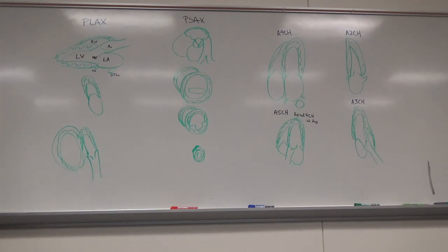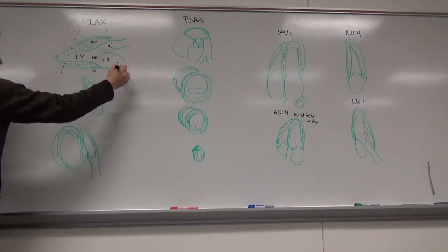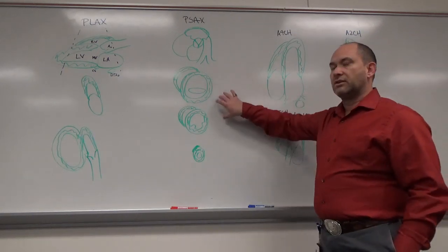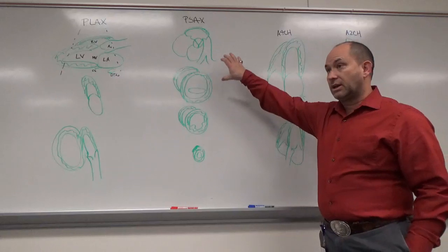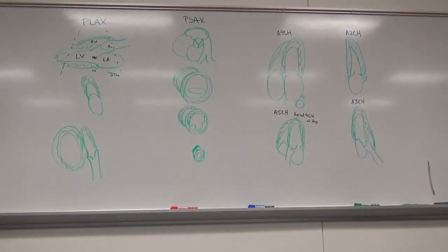Aortic valve, so starting at the top where the transducer is, where's our transducer in that? It's on top. Oh yeah, it's like this. Yes. So my transducer is assumed in all of these pictures, the way I've drawn them, to be directly above the heart. We can see different views, like when we get to some of these short axis, for example, when we're looking at some of these from subcostal, it's going to look identical to these, it's just twisted differently. Okay, so it's important to understand what we're looking at there.